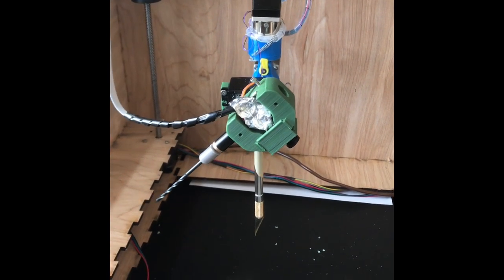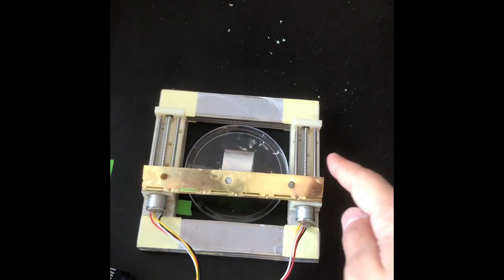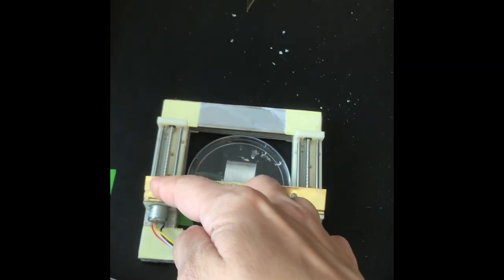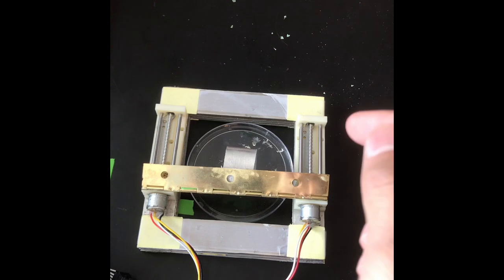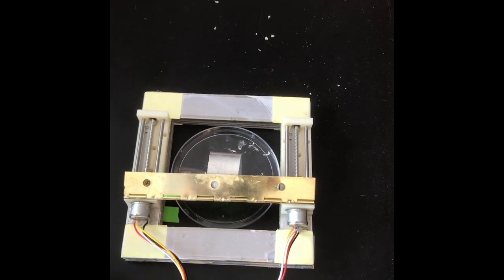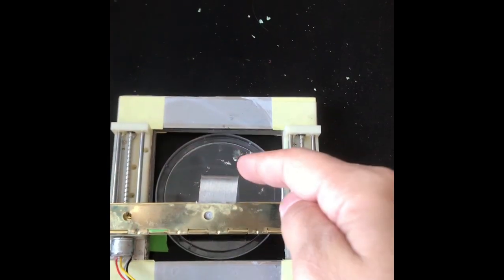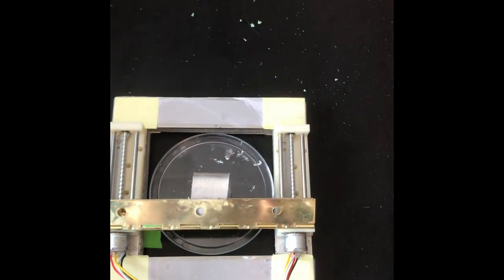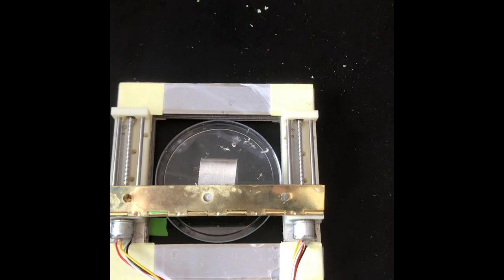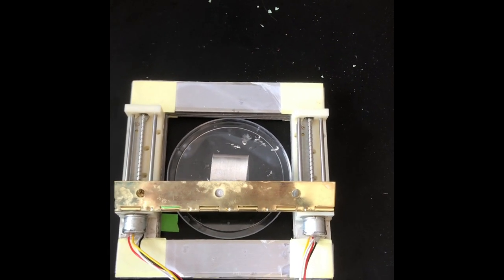Now along with this end effector we have the spreader. So in this we have the 2 spreader mechanisms, one over here and the other one is this, which would help in moving the spreader forward and backwards such that it would insert this portion into the peeled off part of the brain and then move it back, thereby increasing the area of the operation.